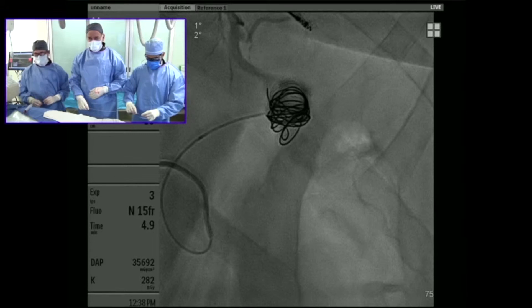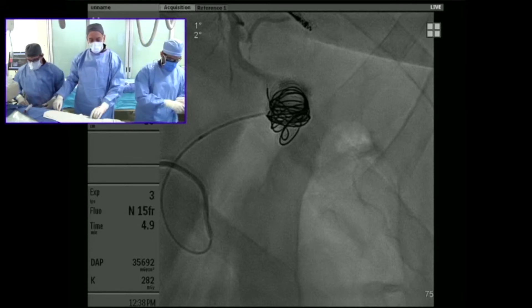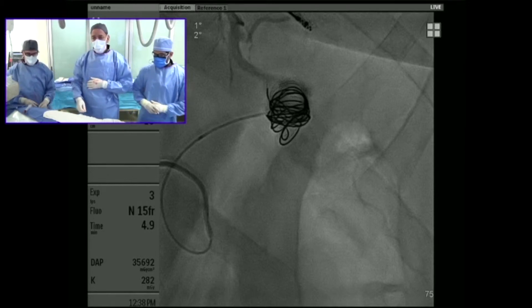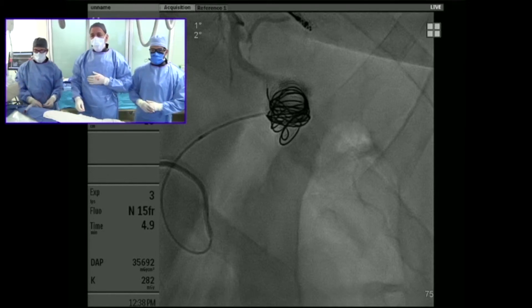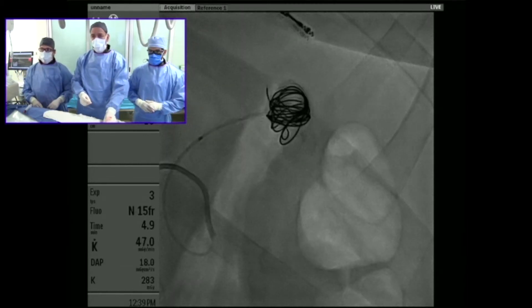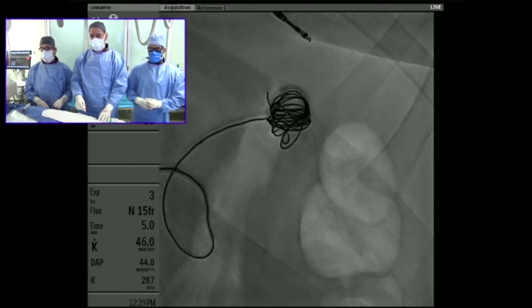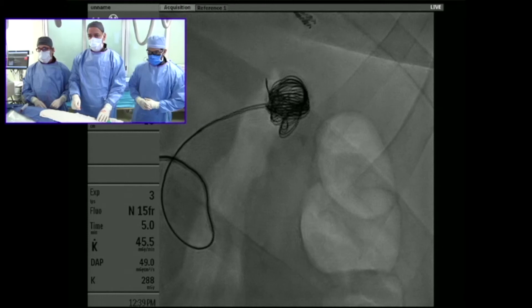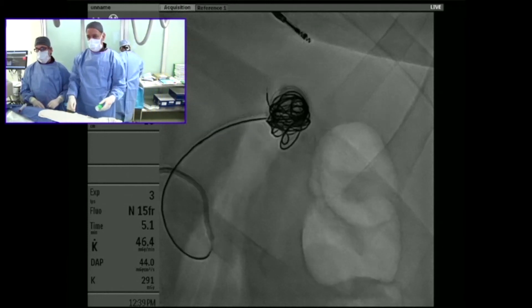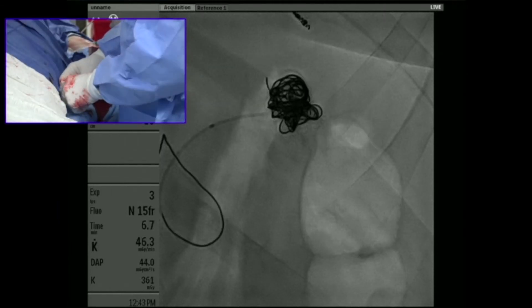The next coil we're using is a smaller coil, which we push through. This is a very helpful coil for patients who are on anticoagulation because it doesn't rely on the clotting cascade to thrombose the vessel. As you can see, I'm pushing this coil with the pusher wire and once I get into the sac I'm filling in the gaps where the framing coil created the scaffold.